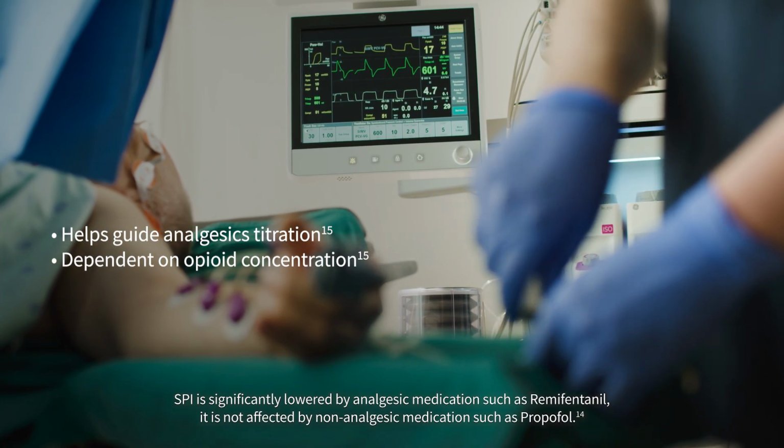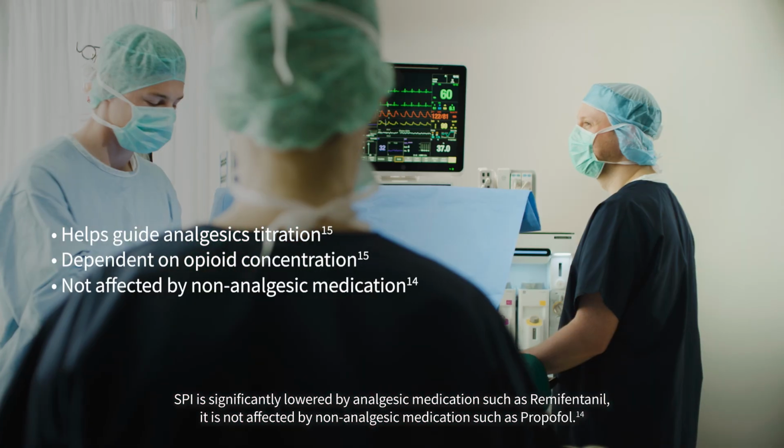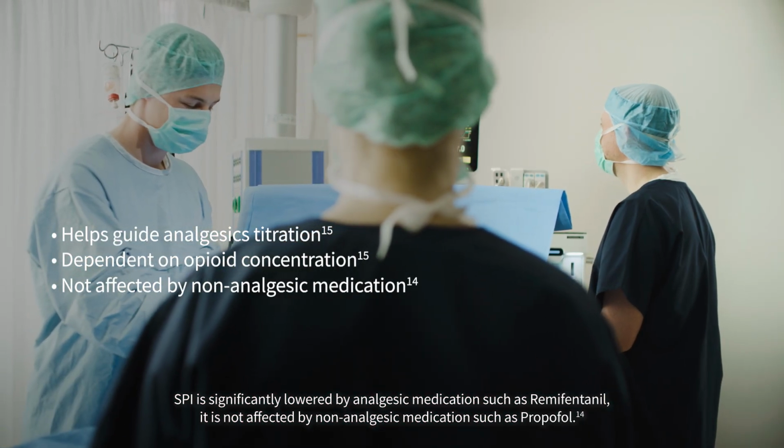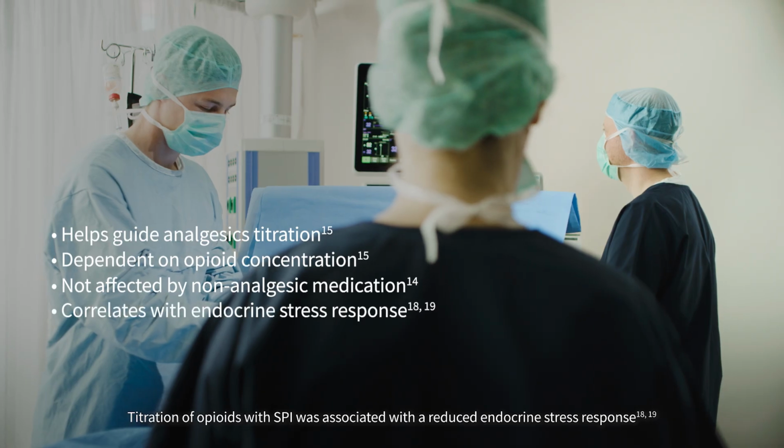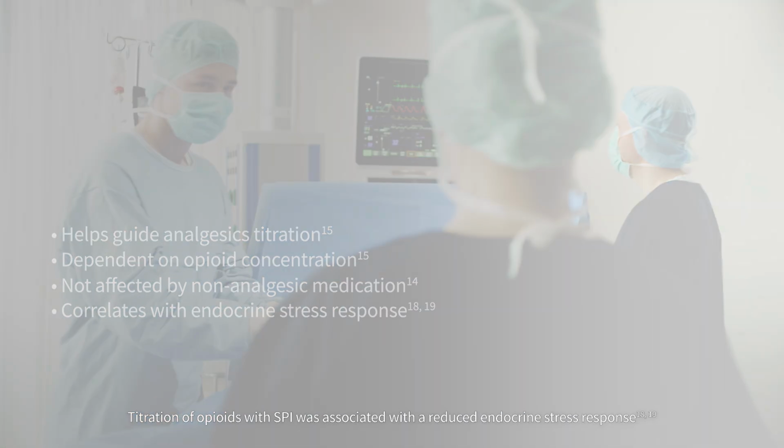SPI is significantly lowered by analgesic medication such as remifentanil. It is not affected by non-analgesic medication such as propofol. Titration of opioids with SPI was associated with a reduced endocrine stress response.